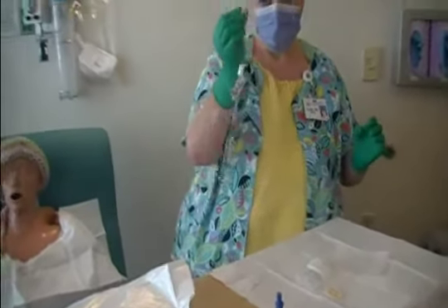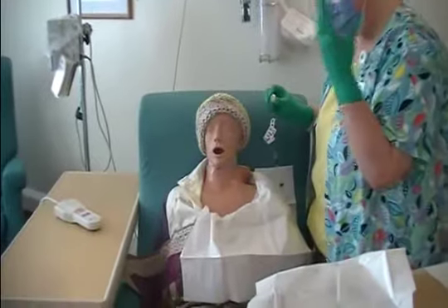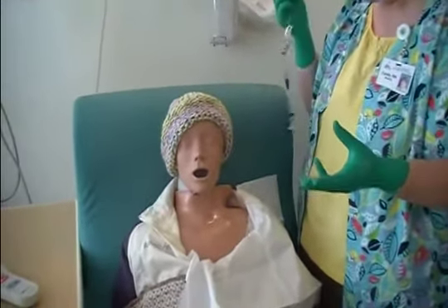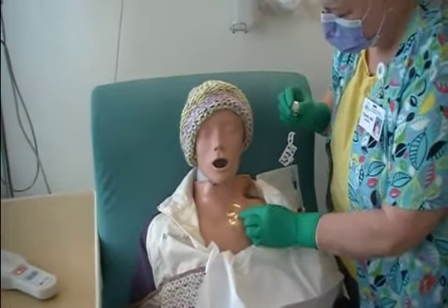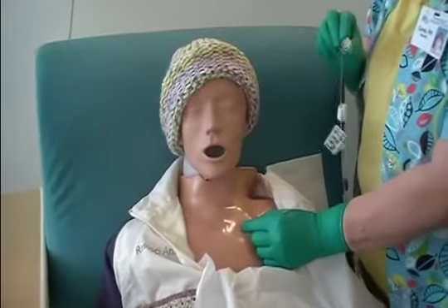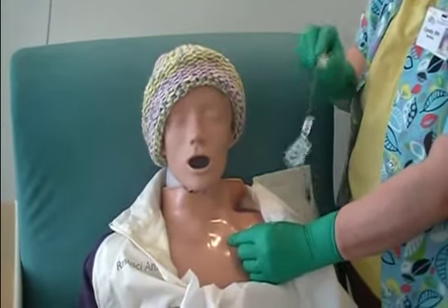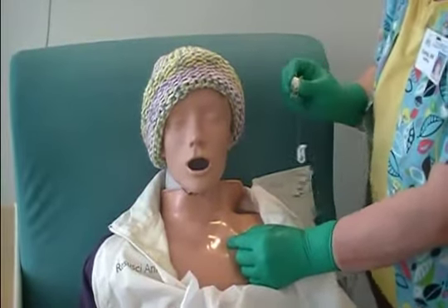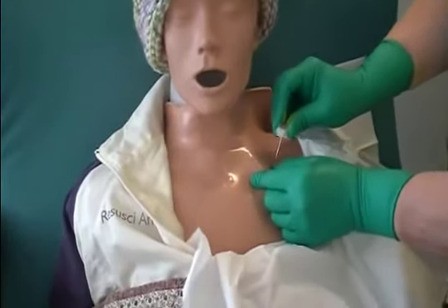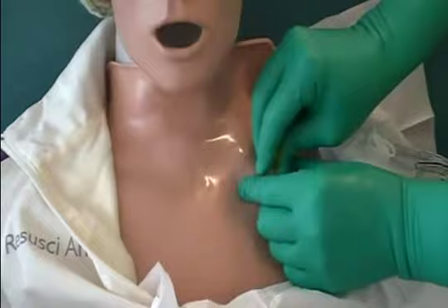I have my one-inch needle, and I'm going to come in here. With this hand only — it's the only hand I'm going to put on the skin; this other one stays sterile. I'm going to palpate again and get a hold of that port. This doesn't hurt the patient — what hurts more is if you try to stab it and you miss it and have to fish around for it. So I know that port is going to be right down in the middle, because I'm going to go right down in between these two fingers and down into the port.